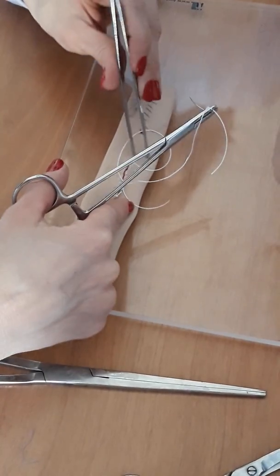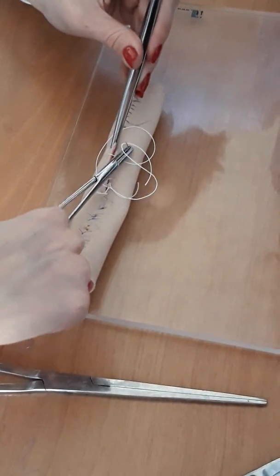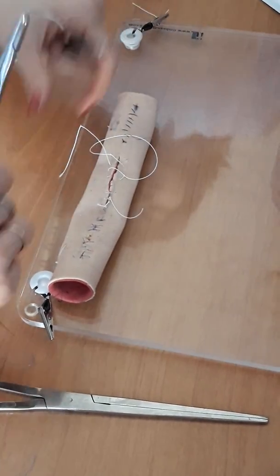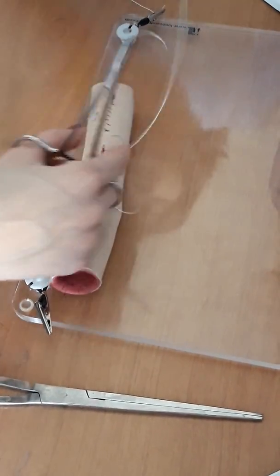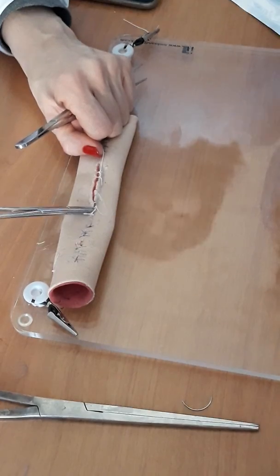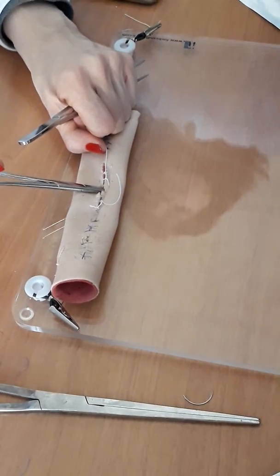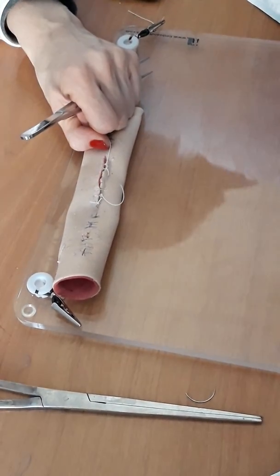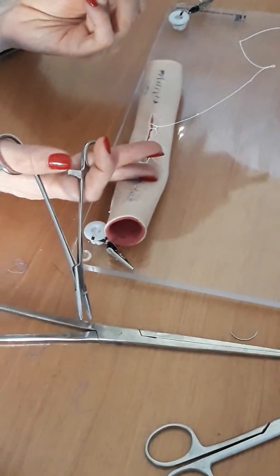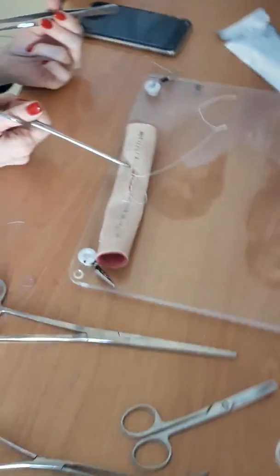Make a loop, grab 5 millimeters on one side, 5 millimeters on the opposite side in the loop, and after that, what should you do? Tie it. Look please. Do you understand me? What difference is between continuous suturing, Schmieden suturing, and Multanovsky-Reverdin suturing? Okay. Penetrate suturing. As usual, the surgeon uses the penetrate suturing for the first row.